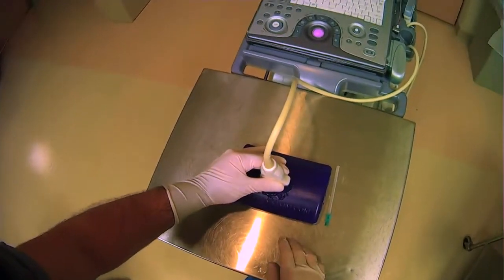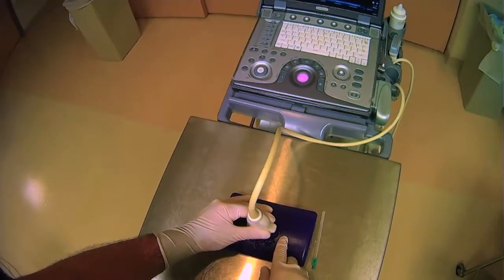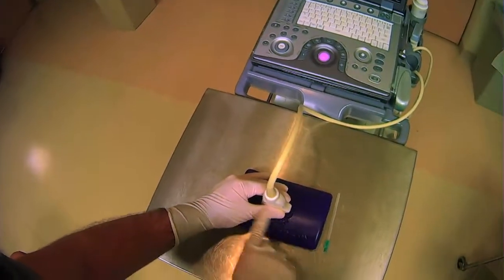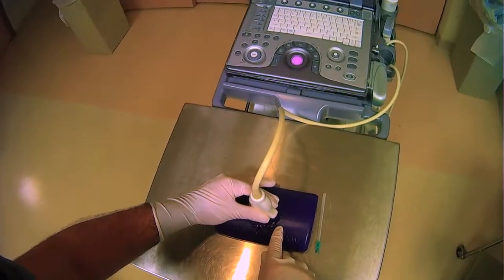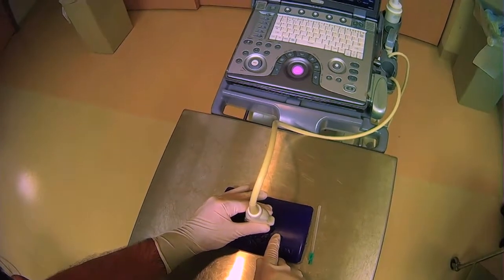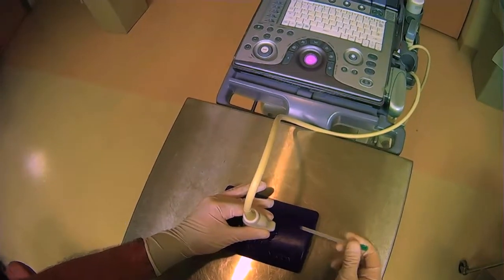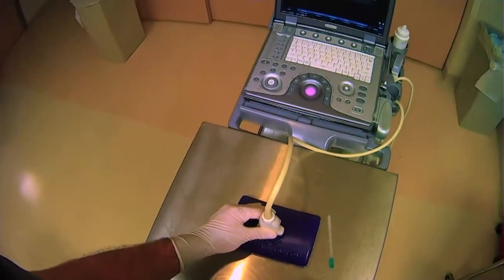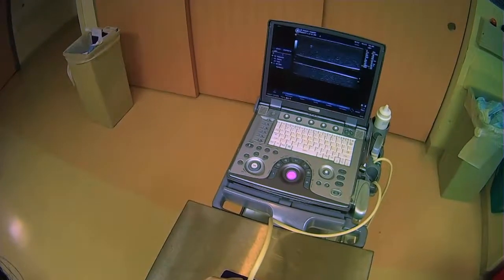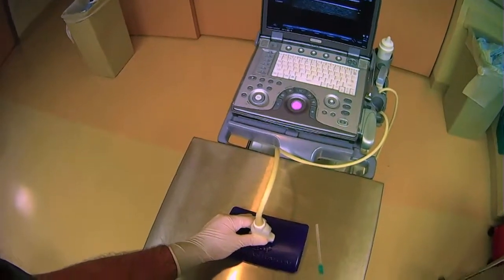Finding your target and centering it is very, very important. Similarly, you want to make sure that not only have you centered your target on the screen, you've also centered it with respect to its margins. Make sure that you're always keeping your probe aligned properly and not obliquing things unnecessarily. If you oblique your probe and go in straight, after a certain point you'll get outside the view of the probe. It's very important to line up your target well, keep your probe aligned, and cut down on the variables once you start the ultrasound-guided portion of your procedure.